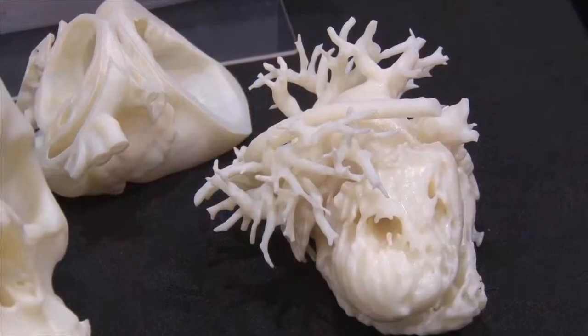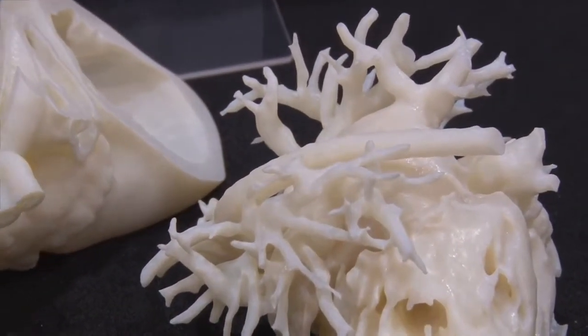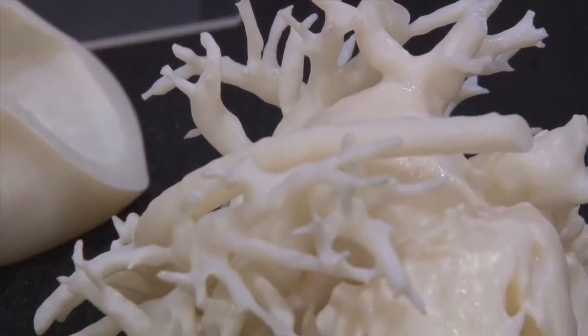Absolutely. Well, this is an excellent meeting to begin with, the Society of Cardiac CT. With the 3D printing evolution at Henry Ford Hospital, we get a lot of high-risk patients that are turned down for surgery. So for any kind of high-risk valve procedures that we don't have a good visualization for, we found that if we use 3D modeling and 3D printing and advanced techniques, we can take a patient's heart outside their body while they're at home waiting for the procedure to be planned and get a better perspective of what we're dealing with before we actually go into the case.